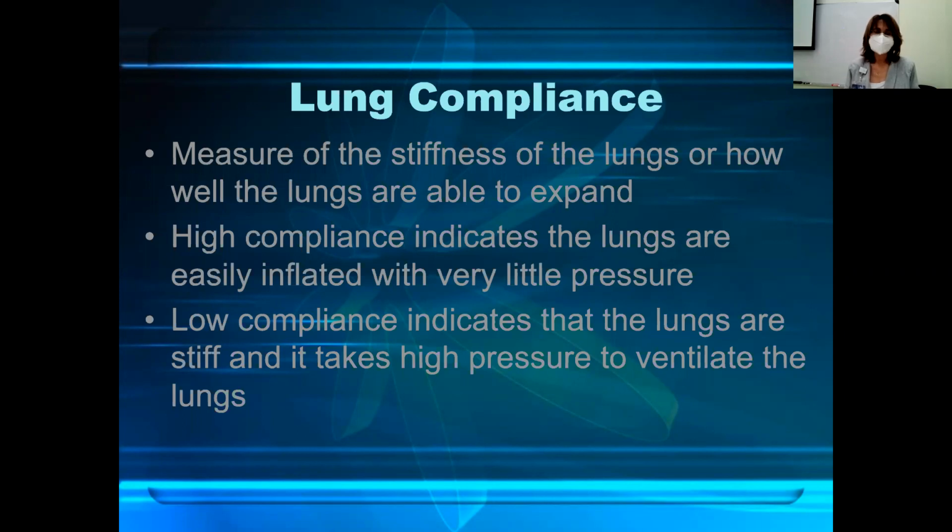Low compliance indicates that the lungs are stiff and it takes high pressure to ventilate the lungs. So low compliance, the lungs are stiff, and we have to use a lot of pressure to push the volume of air into the patient's lungs. And we'll notice that a lot of pressure builds. 30, 35 centimeters of water, 40, which is really bad.